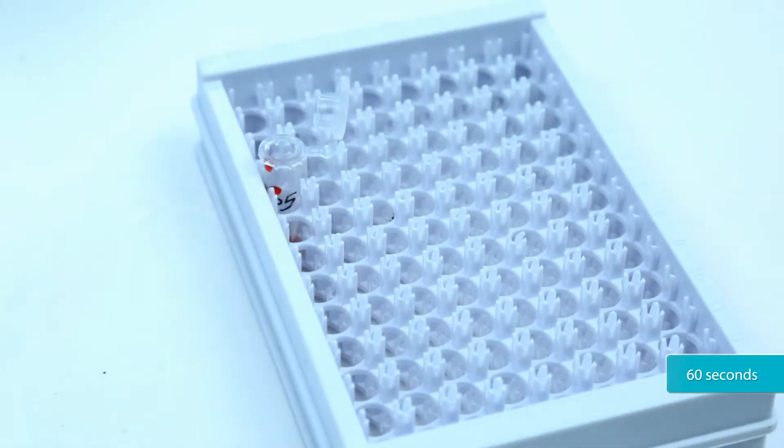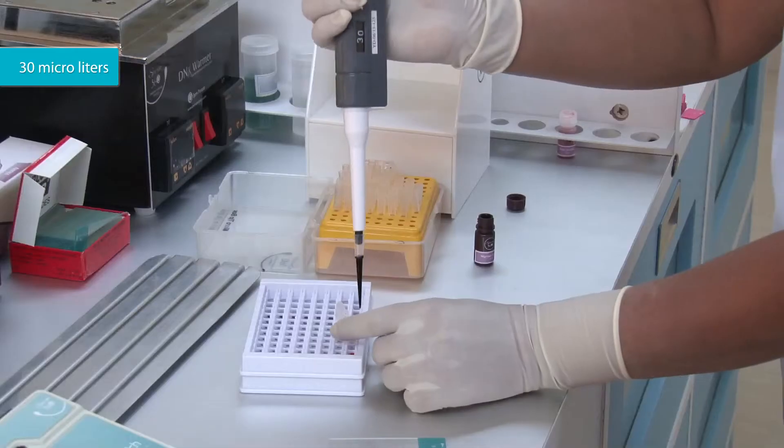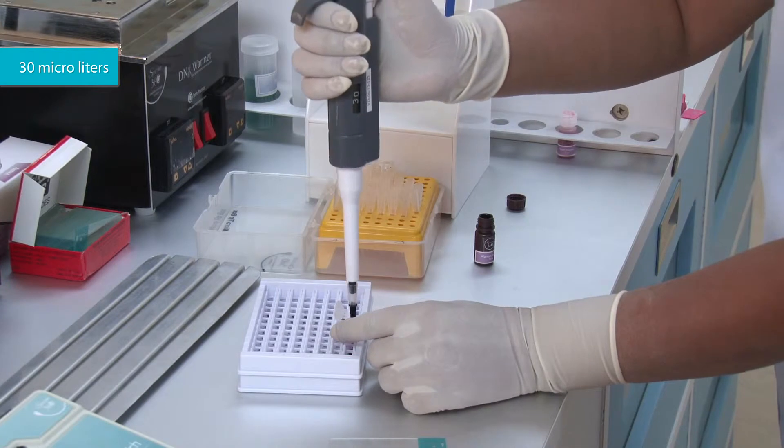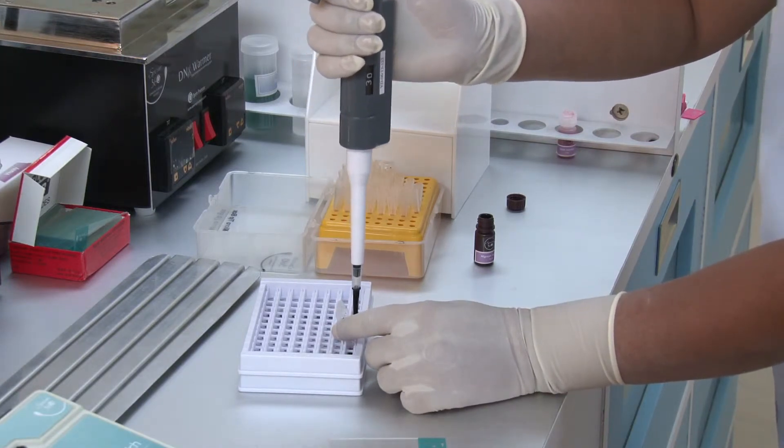Wait for 60 seconds. Then add 30 microliters of nigrosin dye to the microtube. Mix the dye and semen using a pipette tip.